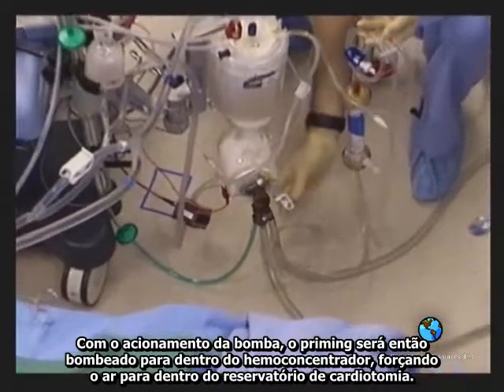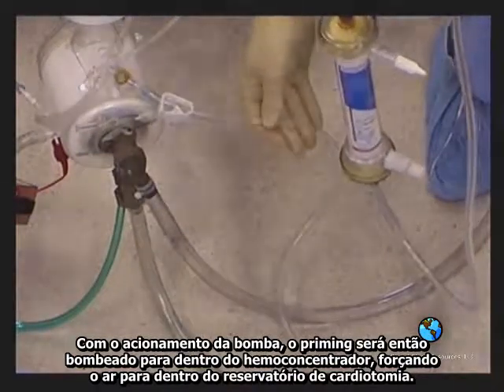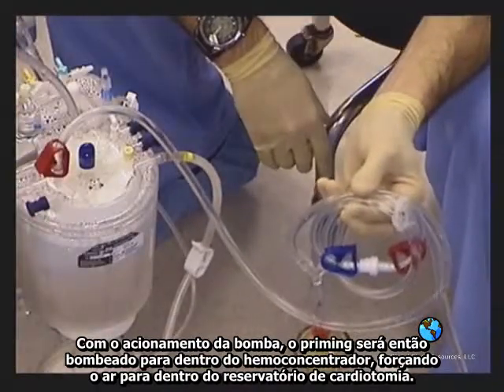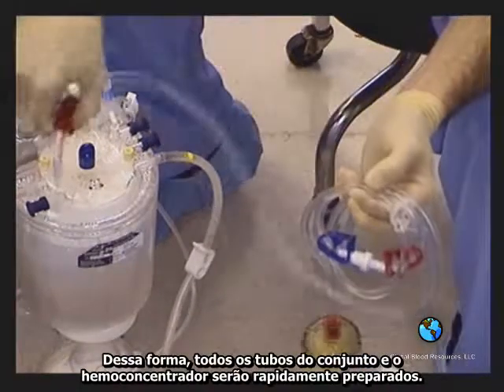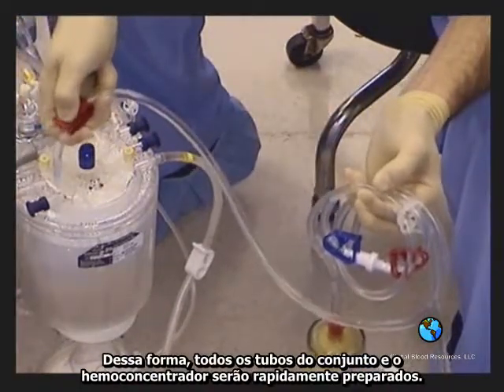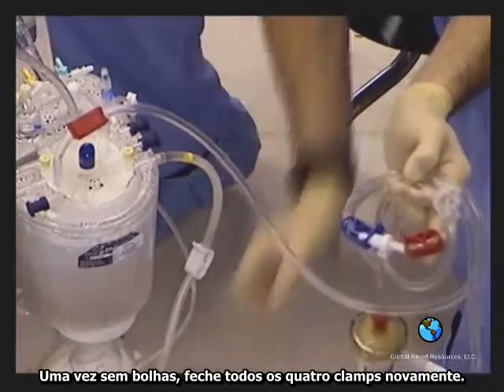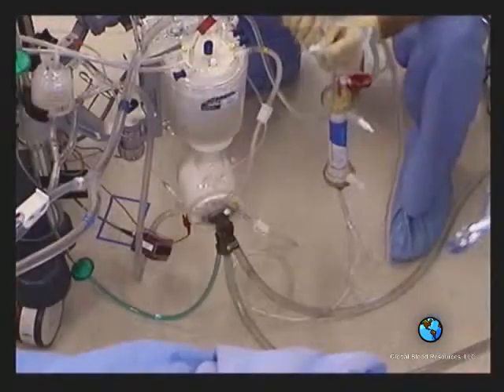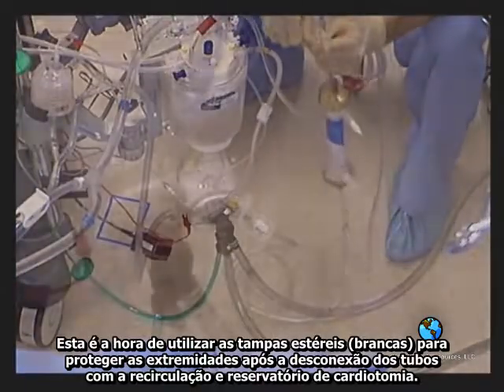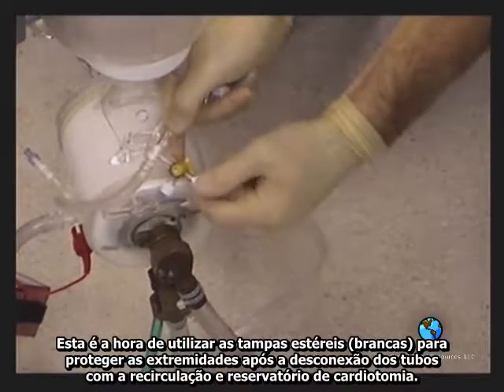Make sure to add appropriate volume to the reservoir for priming the tubing set. Open the last white pinch clamp and walk the air to the bottom of the hemoconcentrator. The complete tubing set and hemoconcentrator will prime quickly from both sides. Once debubbled, close off all 4 pinch clamps again back to the high pressure source. Now it's time to use the sterile dead end caps to completely and sterilely remove the primed tubing set.